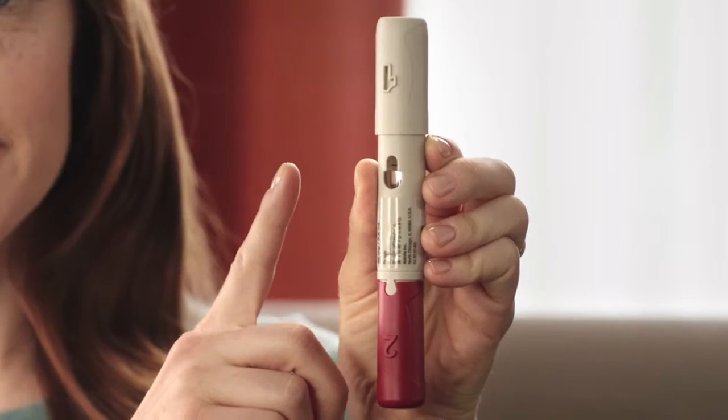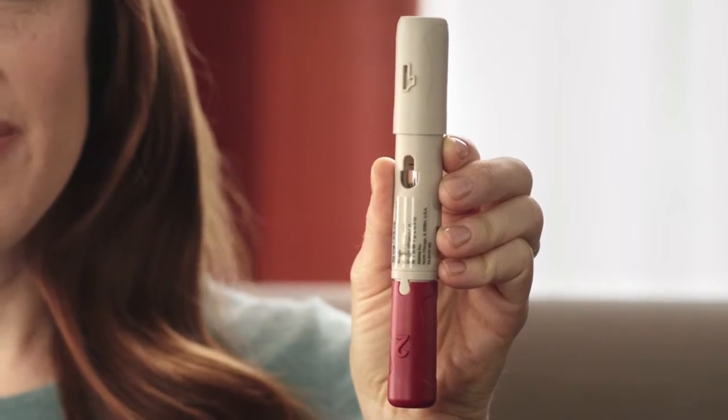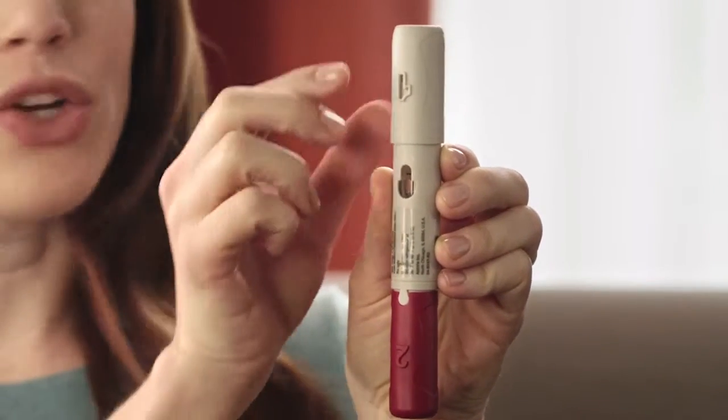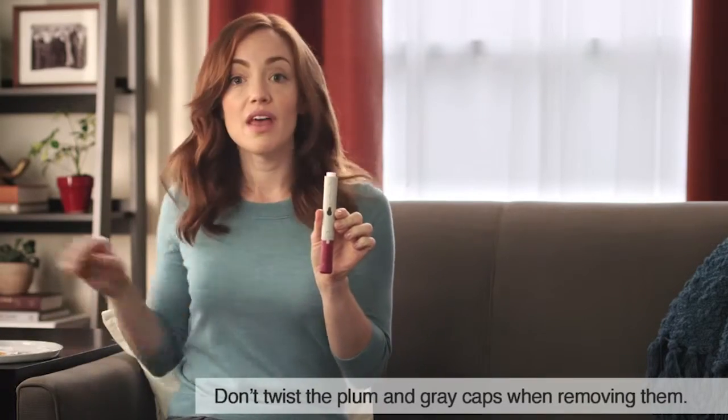With clean hands, I wipe the spot I'll be injecting with an alcohol pad, careful not to touch the area again. Pick up the pen with the gray cap pointing up. I hold the middle of the pen with one hand so that I'm not touching either of the caps. With my other hand, I'm going to pull that gray cap straight off without twisting it. The small gray needle cover inside the cap should come off along with the cap. You don't want to recap the pen, and be careful not to touch the needle. If a few drops of liquid come out of the needle, no problem.